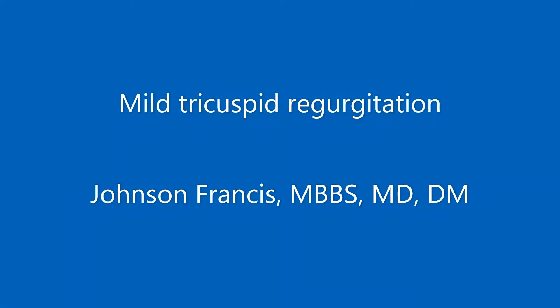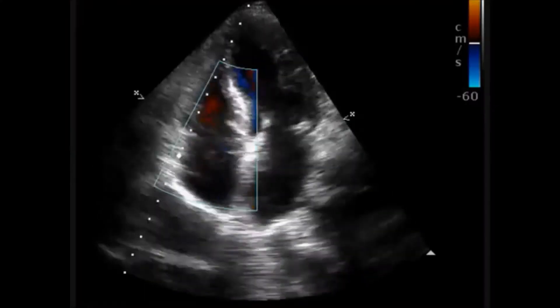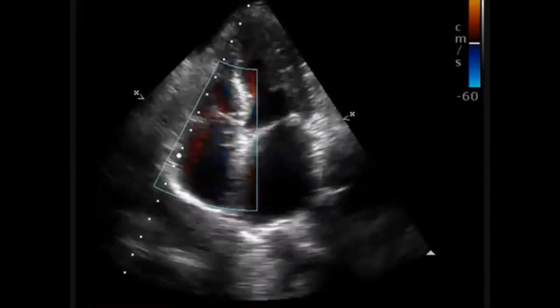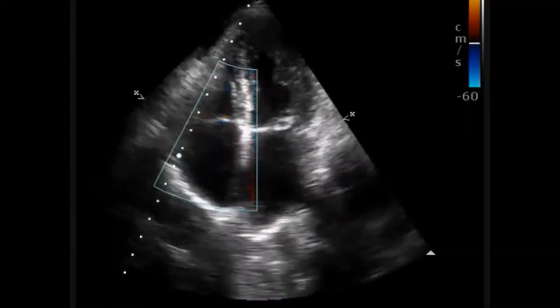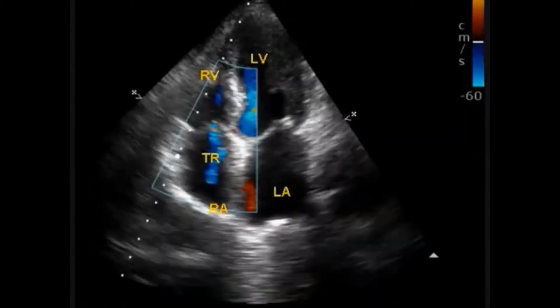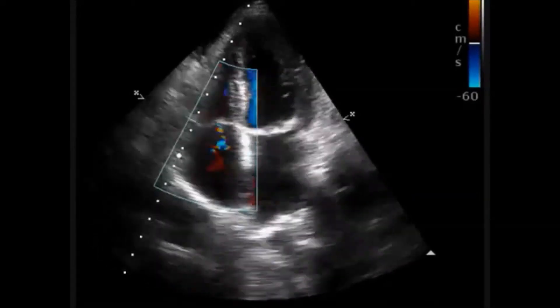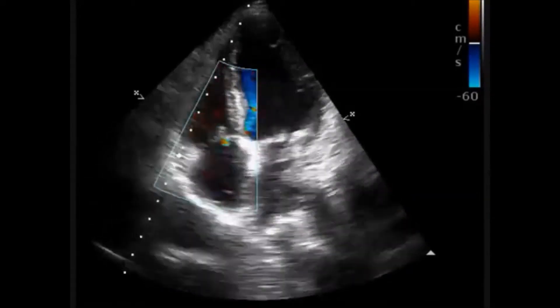This colored Doppler echocardiogram shows mild tricuspid regurgitation and borderline pulmonary hypertension. The apical 4-chamber view shows mild tricuspid regurgitation as a mosaic jet.